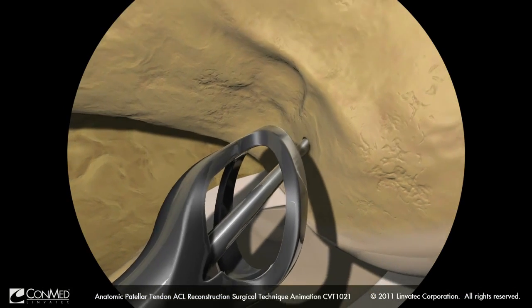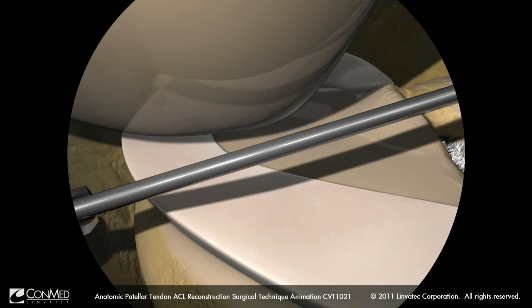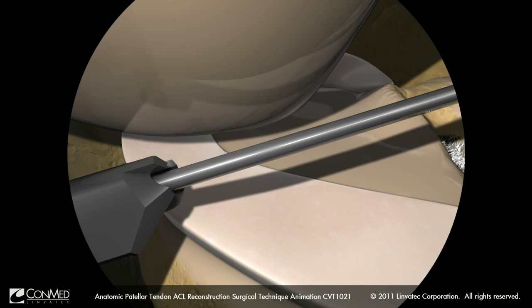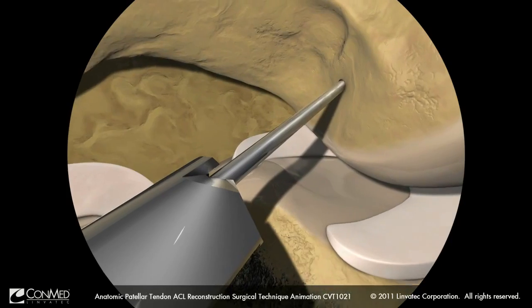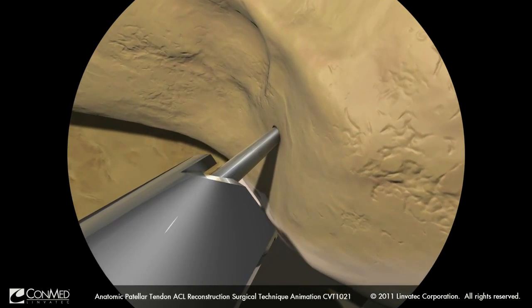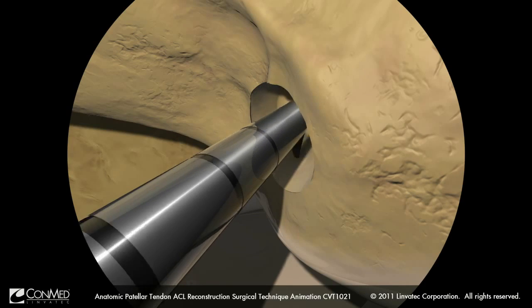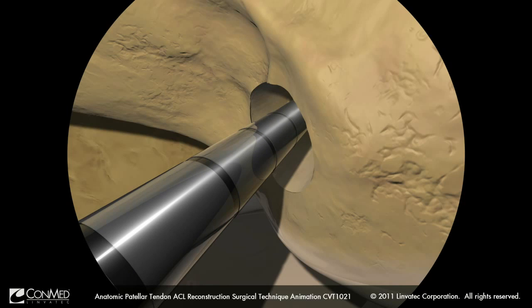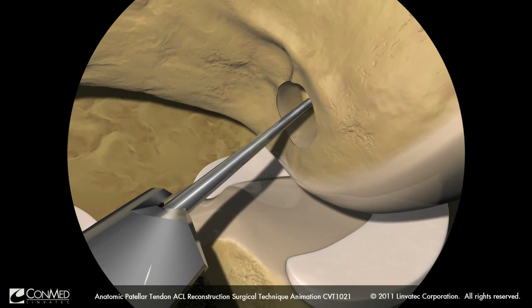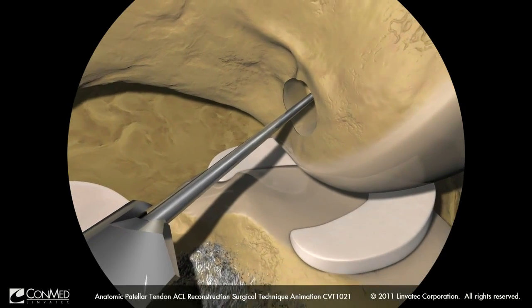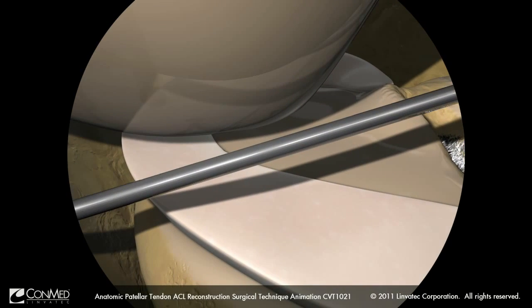Use a twisting motion to remove the femoral footprint guide. Insert the mono-fluted sentinel drill bit over the guide pin through the accessory anteromedial portal with the cutting edge facing away from the femoral condyle, and advance the drill bit to the femoral ACL footprint. Using a piston-like back-and-forth motion, advance the sentinel drill bit to the desired depth cautiously to prevent blowout of the lateral femoral cortex. Pull the drill bit back slowly until the blade is visible in the joint space, then slide the sentinel drill bit past the medial femoral condyle and out of the portal, keeping the blade oriented away from the condylar surface.